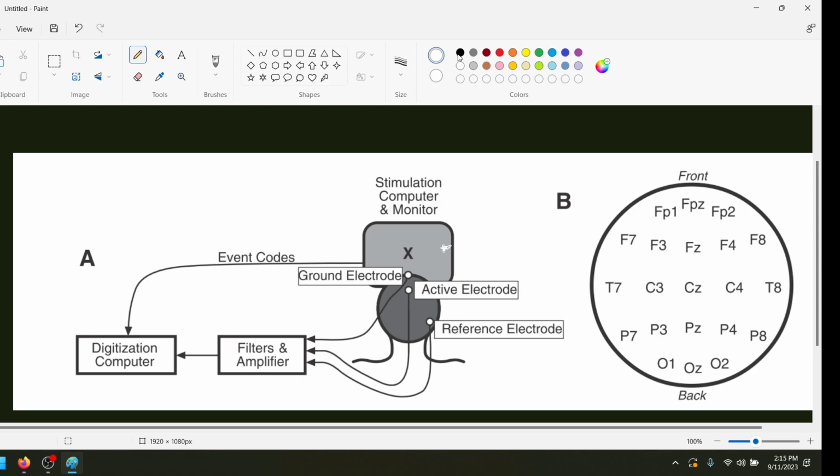Let's say that's what's happening, and every time I flash an X or an O, that area of the screen is also going to flash at the same time. I'm then going to connect a photosensor, which is going to be this guy right here. And wow, this really sucks on a trackpad. And I'm going to plug that photosensor into my amplifier.